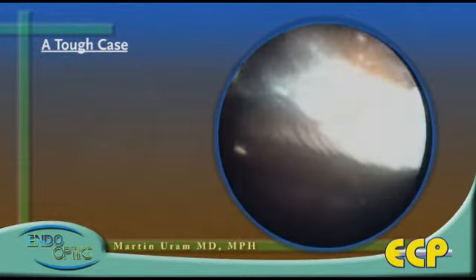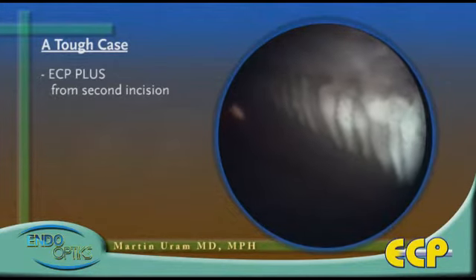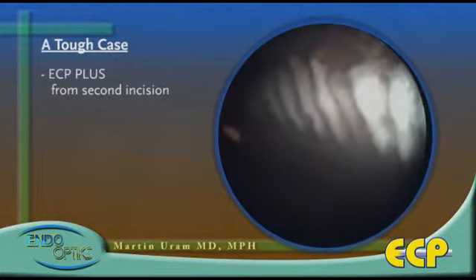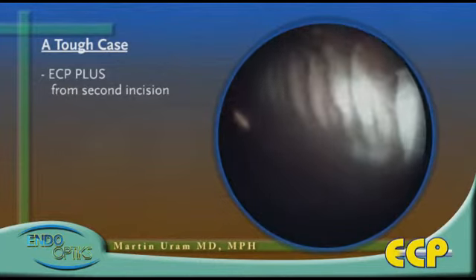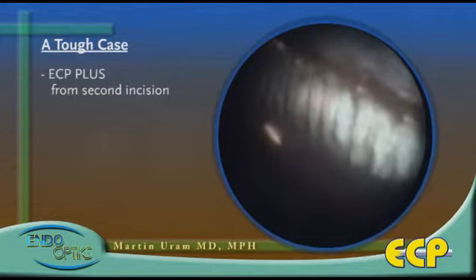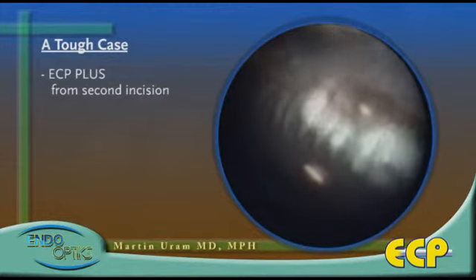A second sclerotomy site is observed, and we're approaching the ciliary ring from a different point of view. Again, the ciliary epithelium is completely lasered without causing explosions, and a confluent row of photocoagulation lesions are also placed below the tails of the ciliary processes onto the pars plana in the so-called plus treatment.